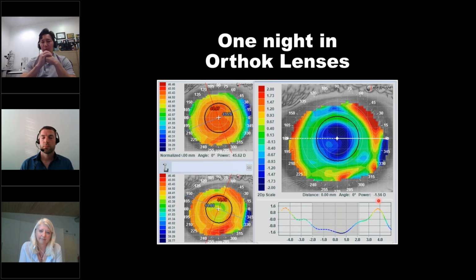So the reason why we might suggest using the axial central power change in the early days of Ortho-K is because refractively the patients will tend to want to, let's call it, eat up the minus. So you may find that the axial visual axis change gives you a really good idea of if you need to push more or less power.